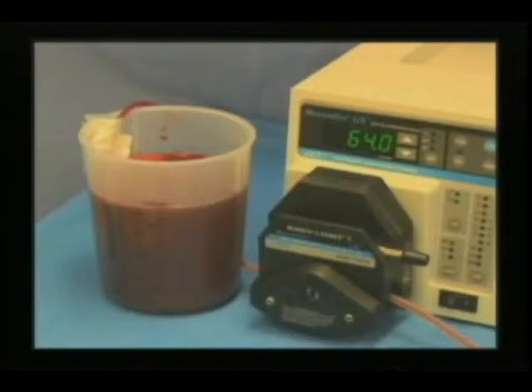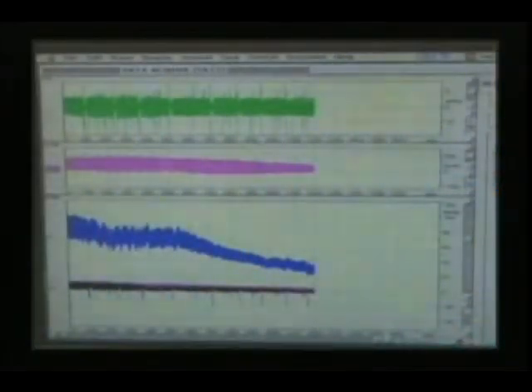We have now removed approximately 50% of the pig's blood volume and removed more than 900 milliliters of blood. At this point, the aortic pressure has decreased to 35 over 25 millimeters of mercury. Peak flow to the carotid is down to approximately 200 ml per minute. The intrathoracic pressure or airway pressure is 2.5 over minus 2.5 millimeters of mercury. Intracranial pressure is down to approximately 5 millimeters of mercury, and right atrial pressure is between +1 and -2 millimeters of mercury.